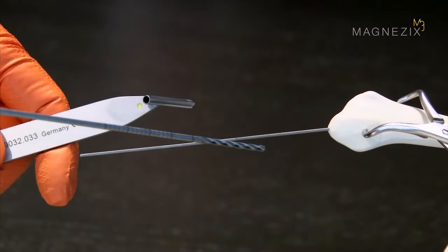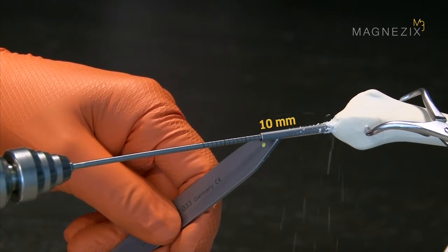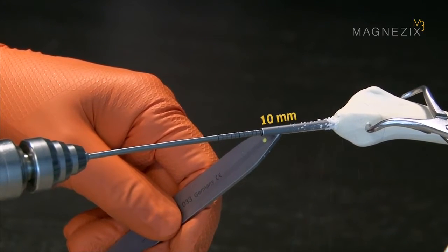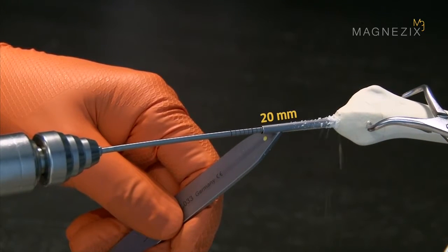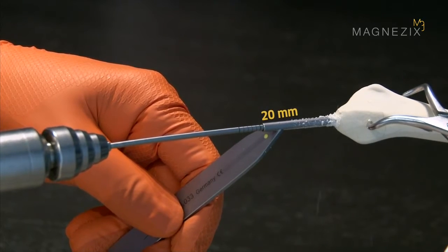The hole is drilled over the guide wire to a depth of 34 millimeters. The calibration of the drill bit makes it easier to read the drilling depth. Each of the fine rings represents a depth of 2 millimeters. Each of the deeper rings represents a depth of 10 millimeters.